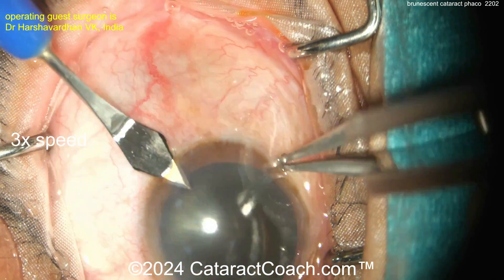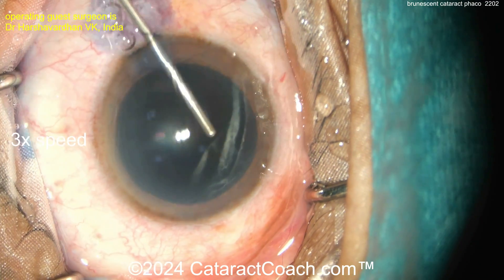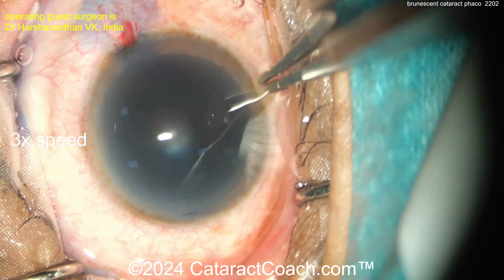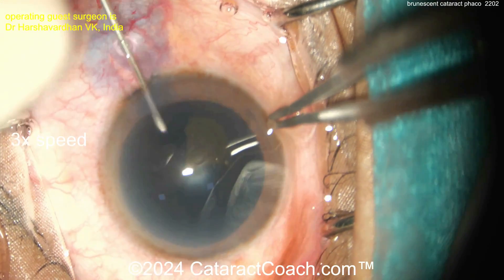Coca-Cola colored. Now making that incision — trypan blue dye going inside the eye, and here's some viscoelastic. Let's see what we've got here. Getting a good rhexis done, poking in with the forceps.